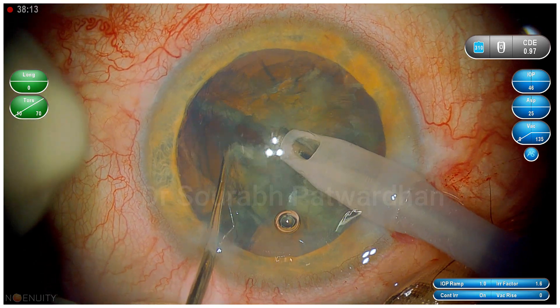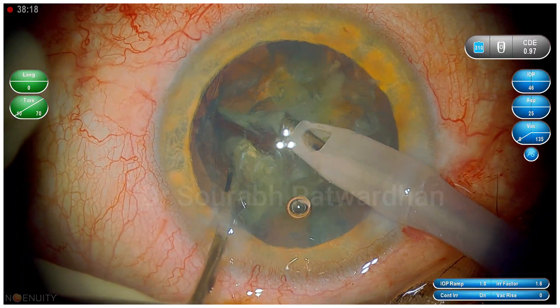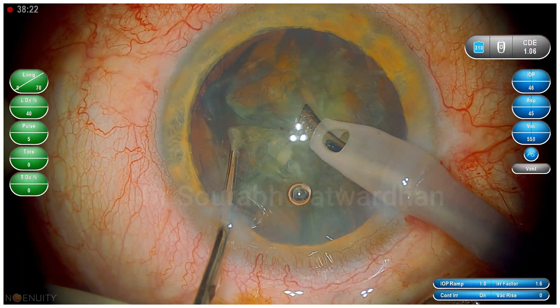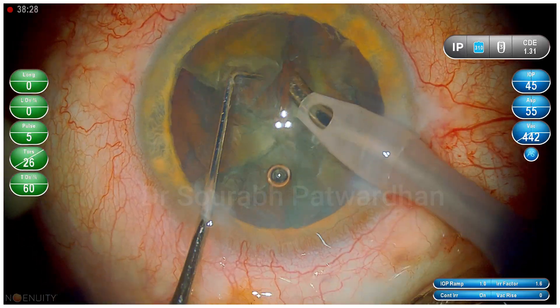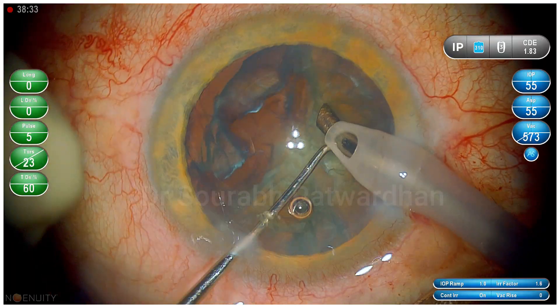Here I am doing just mechanical chops — as you can see, I am not using any phaco energy. I am just dividing this grade 1 to 2 cataract into 4 to 5 pieces. Now I begin the quadrant removal. For quadrant removal I usually use high flow rate and high vacuum so that the pieces which I have made can be aspirated very efficiently.